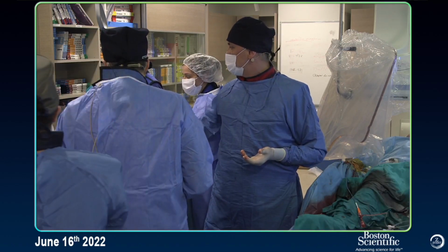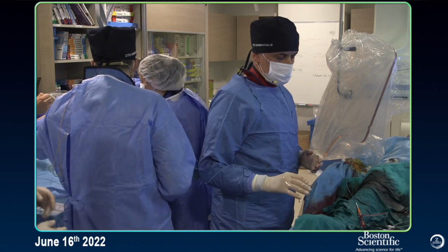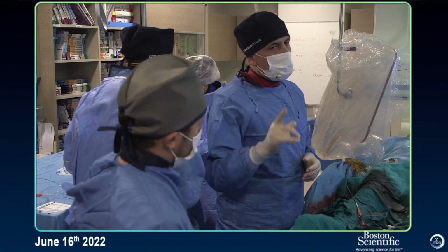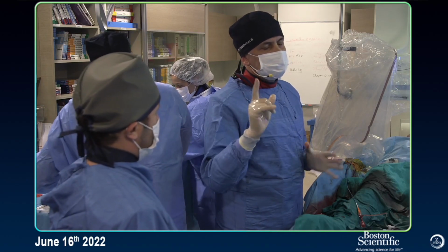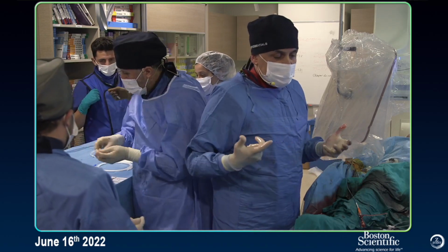So listen. I think the third wire was entangled with the other wires. It's not the issue. It didn't cross. Maybe there is twisting, but I could pull it back nicely, right?